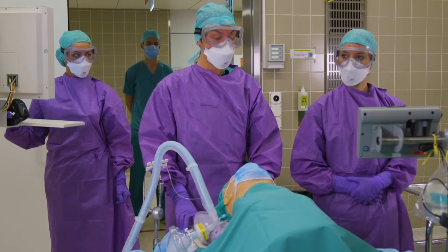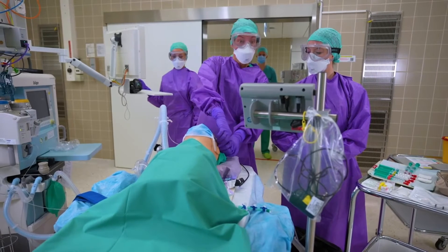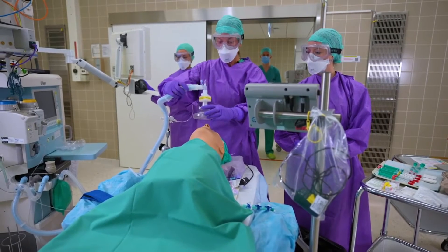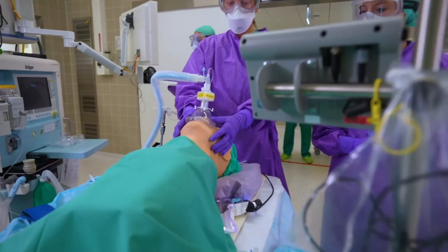We are starting with an adequate pre-oxygenation for about 3 to 5 minutes. Our patient is wearing a surgical face mask, which we have to take off. Then we will pre-oxygenate, and here it's important to have a tight-fitting mask to avoid any leakage.